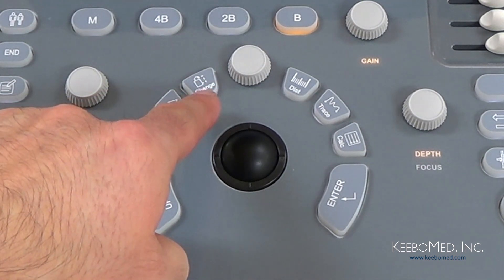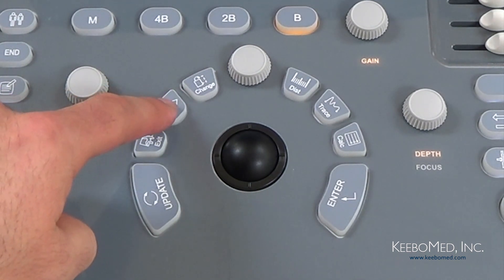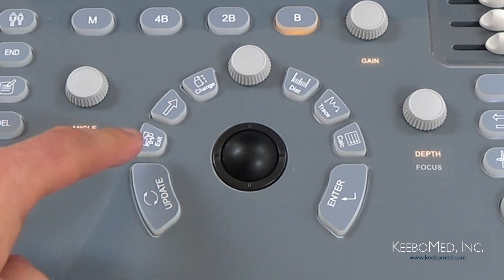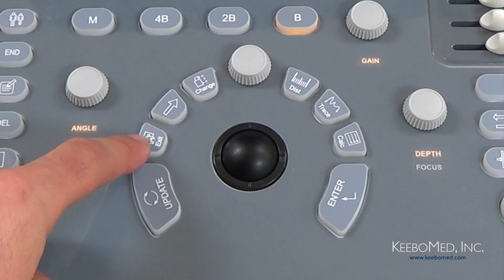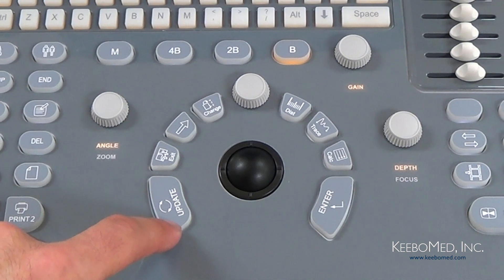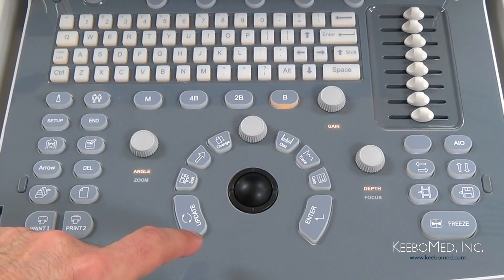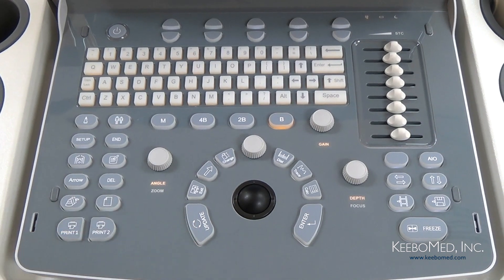Next to the knob we have the Change key, which is used to change between menus. Then we have the Cursor key, which looks like an arrow — pressing it will show or hide the cursor on the screen. Then we have the Exit key — press this at any time to exit menus and measurements and return to the main imaging screen. Finally, we have the Update key, which can be used for several functions: to make selections on certain menus, to change between the starting and ending point while making measurements, or to go back to the previous point while using the trace function.